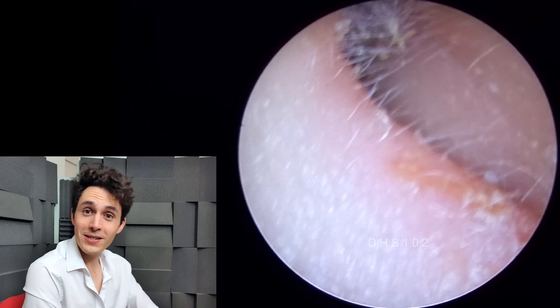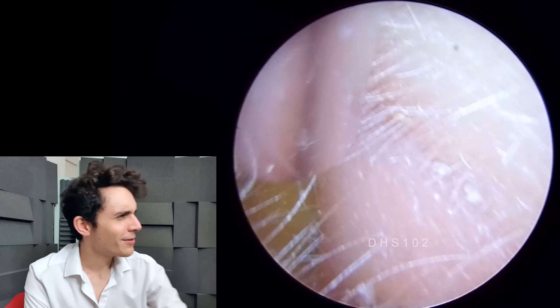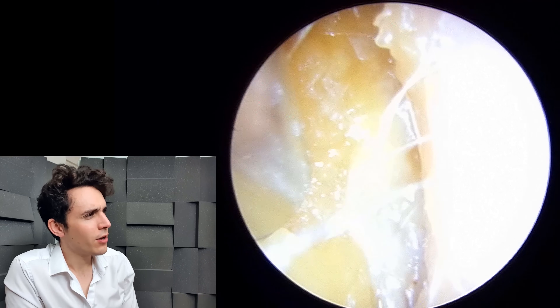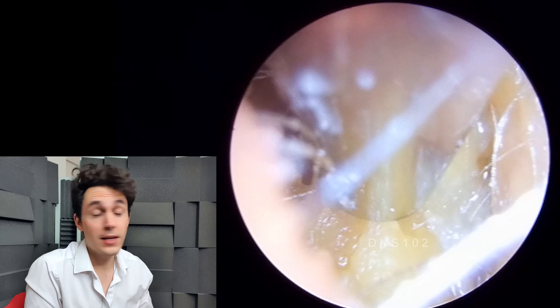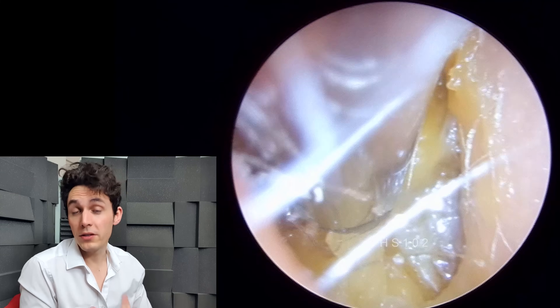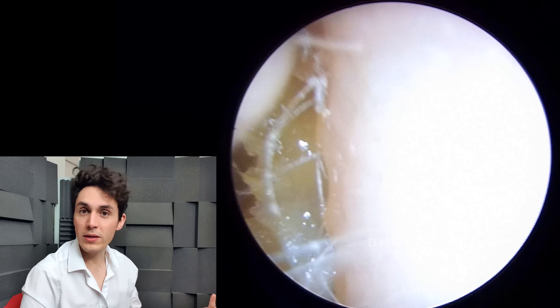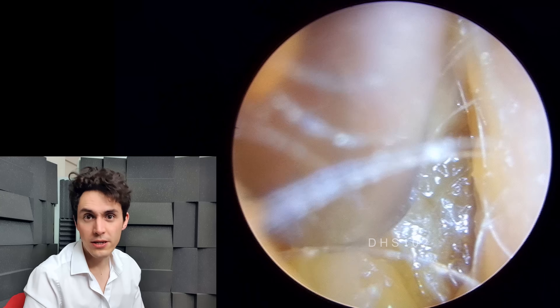Hi everyone, it's Connor here from Durham Hearing Specialists. I hope you're doing well and welcome to another very interesting video. We've got a very nice case of swimmer's ear in this video, what we call otitis externa. So it's a bacterial infection of the outer ear — that's what we typically mean when we say swimmer's ear in the UK.